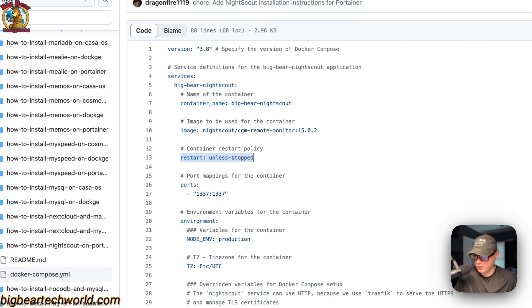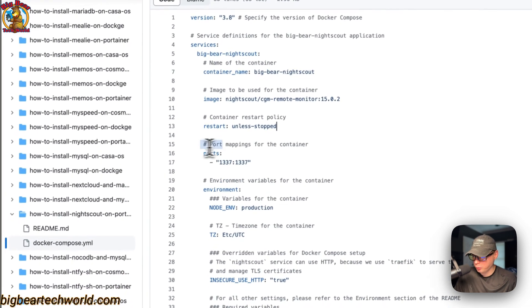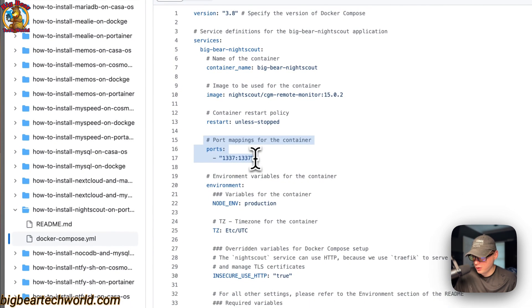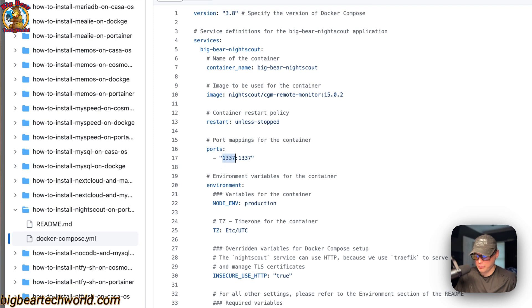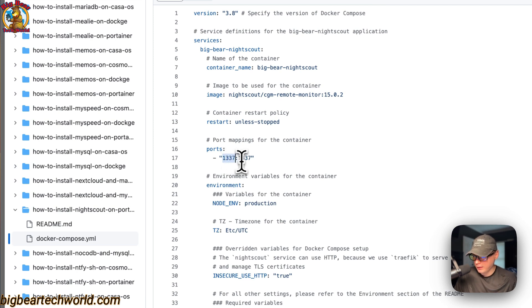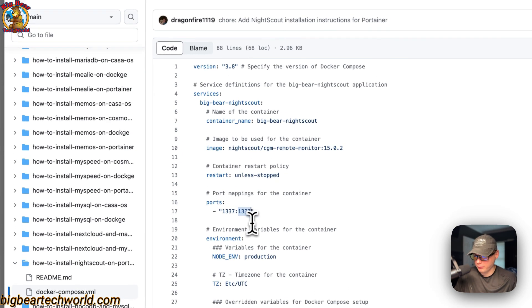Port mappings: 1337 is on the host side. If this collides with another port on your host you can change it. On the container side it is also 1337 — do not change the container side at all.